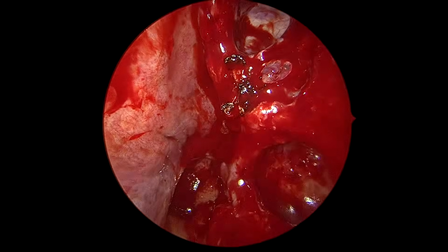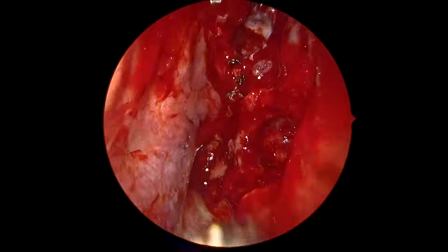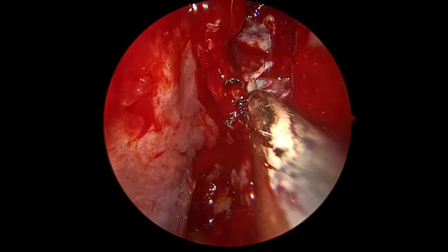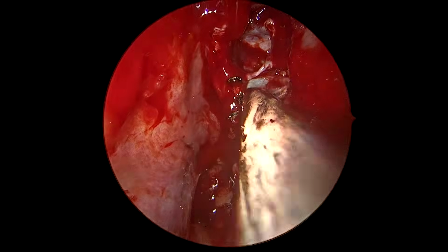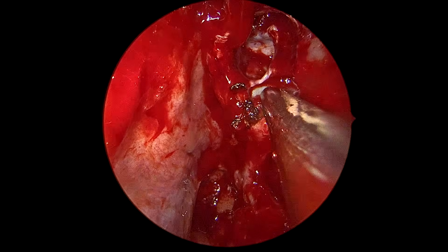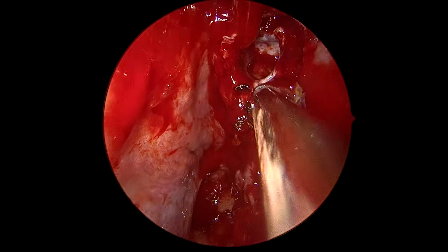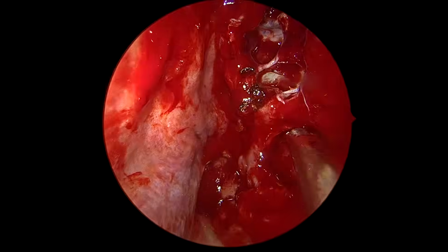To me, the nasal cavity looks fine. I can see the choana. Some polypoidal thickening is being debrided right now. There is no evidence of any residual or any suspicious looking lesion anywhere.